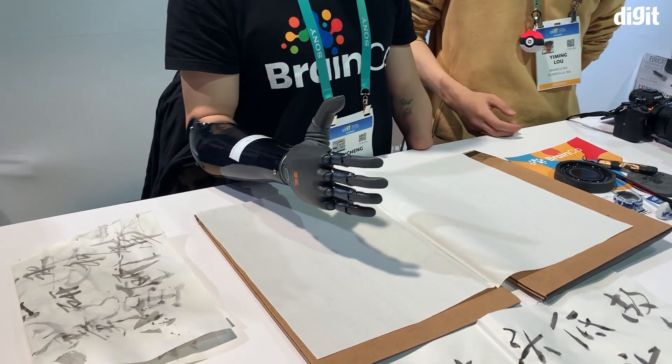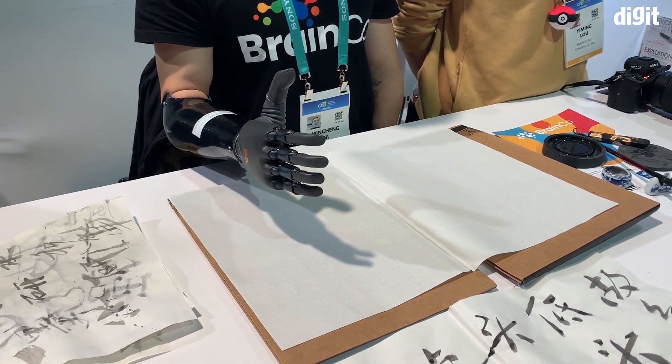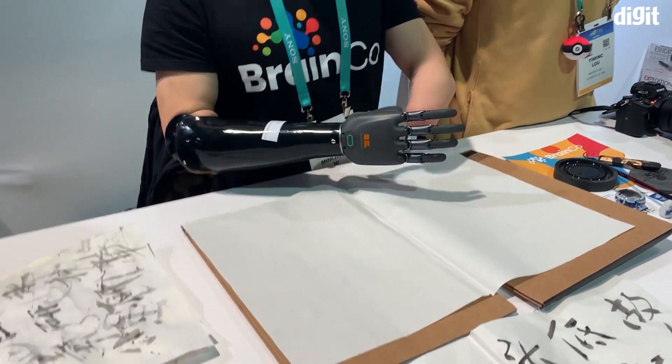The control is actually based on muscle movements. With the way the muscles move in your forearm, you will be able to control the fingers — each individual finger. There is a little bit of a lag, a little bit of delay between the controls, but that's more mechanical than muscular.